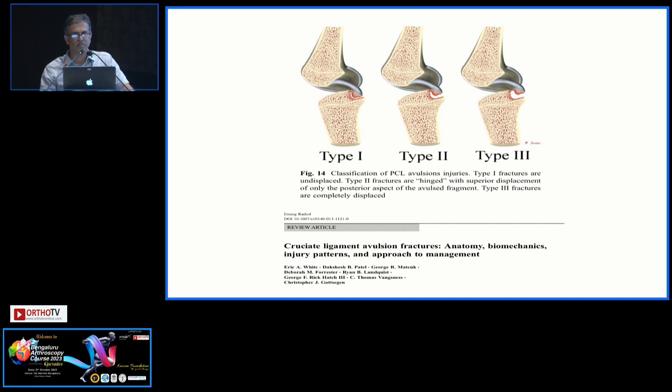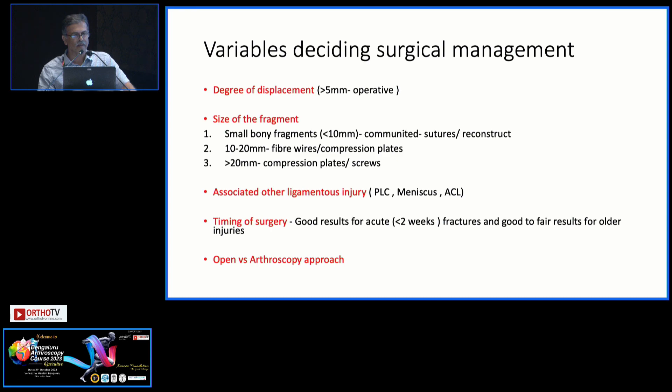This fixation technique that I am showing in the video can be applicable to type 2 and 3, or even sometimes type 1 also, if you want to avoid non-union and other things. There are variable deciding surgical points, and especially the size of the fragment is very important when fixing these avulsion fragments — it has to be 10 to 20 millimeters for the technique I am showing.